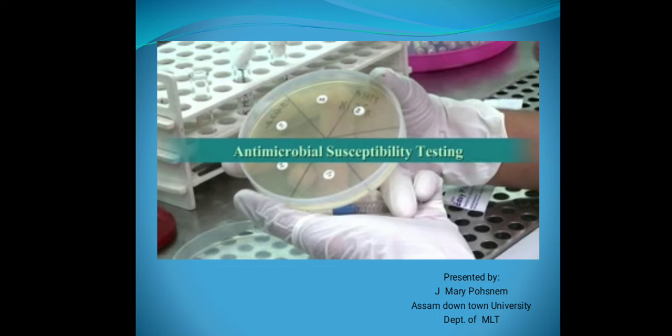The inoculation of the surface of the medium is made with a cotton swab from a broth culture. In clinical applications, the broth turbidity has to match a defined standard. We usually call it a McFarland standard, and care must also be taken to express excess broth from the swab prior to inoculation.